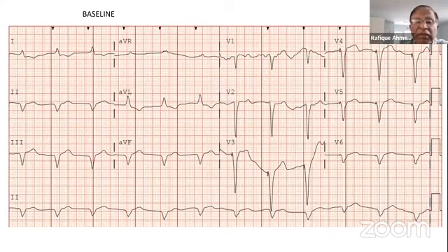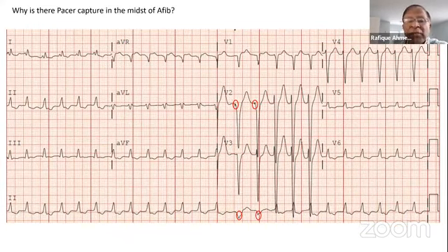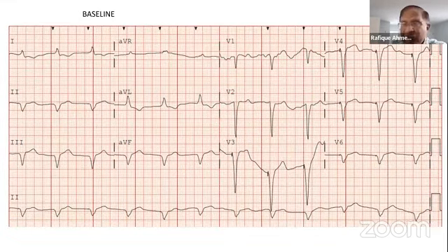So please remember one thing. Modern ECGs are actually electronic machines. They don't write direct things. First thing, I have to make sure that this patient has a pacemaker, because a lot of modern machines have a tendency to put in spikes when there is none. So first I look in the chart: does the patient have a pacemaker? It doesn't matter how much of an expert in pacing I am.